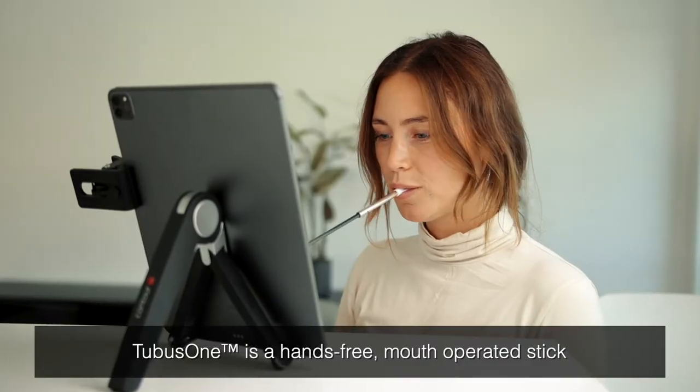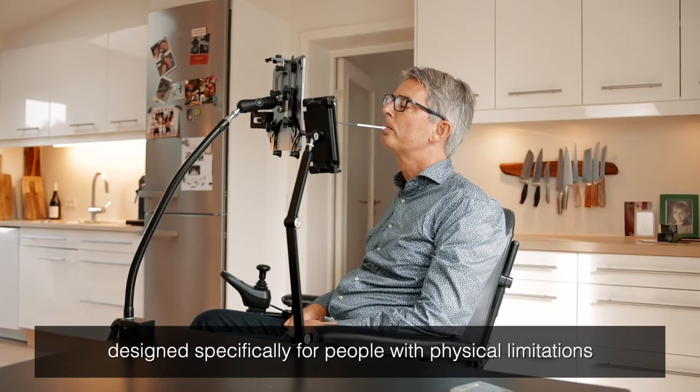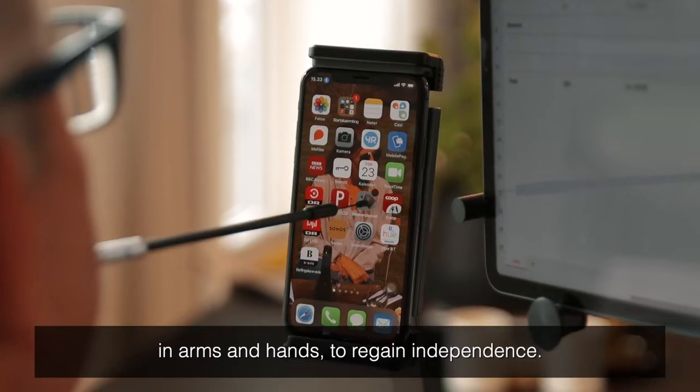Tubus One is a hands-free, mouth-operated stick designed specifically for people with physical limitations in arms and hands to regain independence.